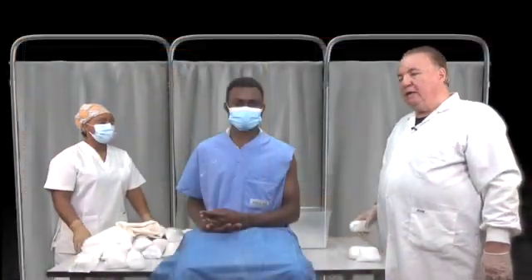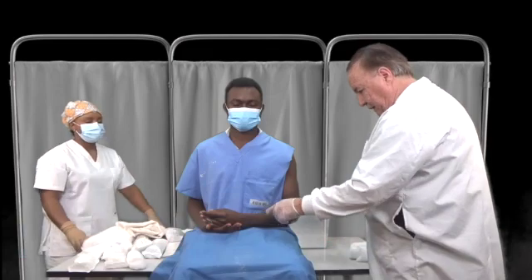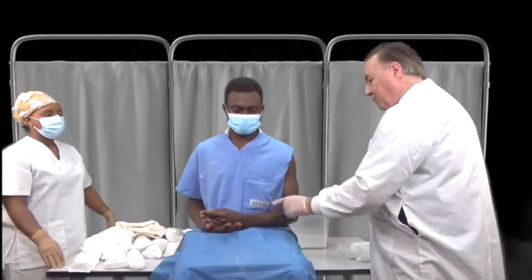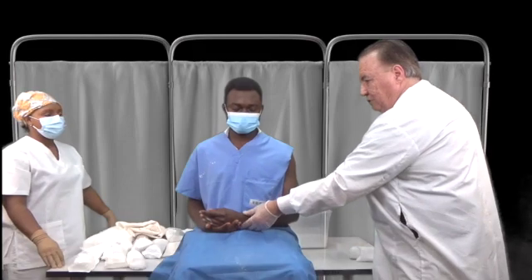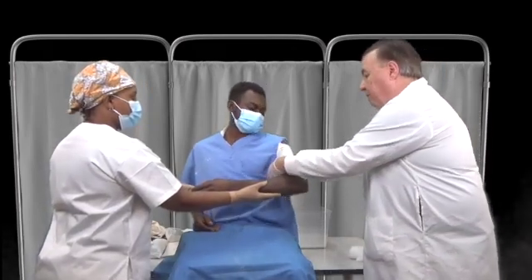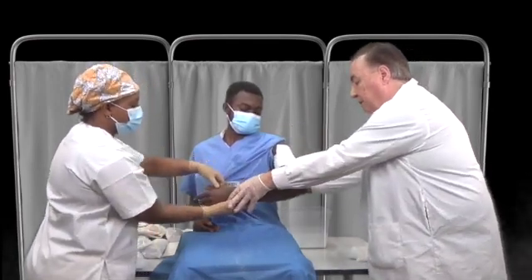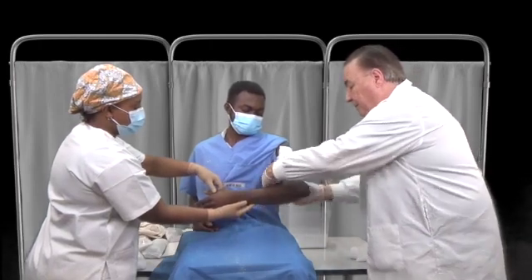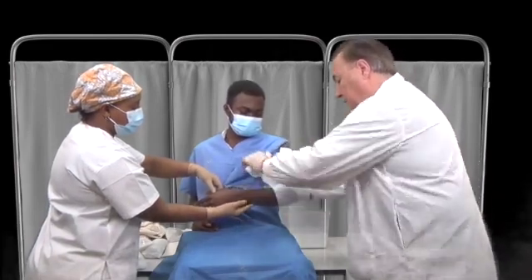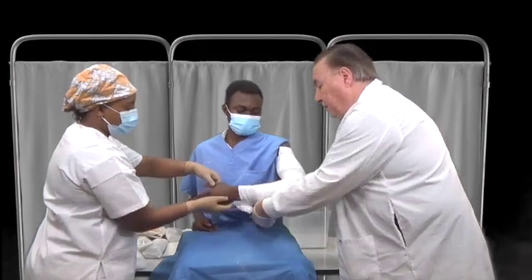We are going to proceed with plaster of Paris immobilization of the upper extremity. Before we do anything, we check and see if there are any injuries to the skin — they should be cleansed and dressed. We're assuming a forearm fracture in this patient. We need to pad the extremity well because the hard plaster can damage the underlying skin. Try not to have excessive wrinkling of the padding.